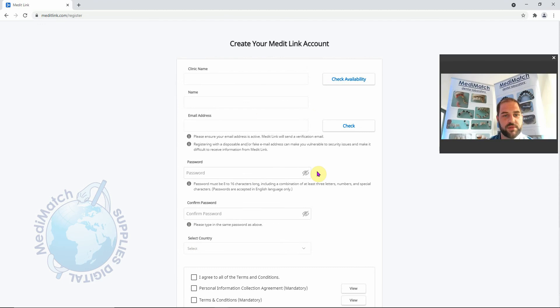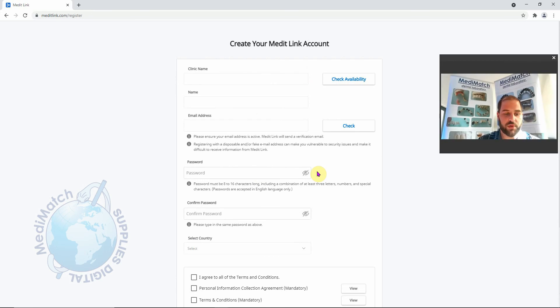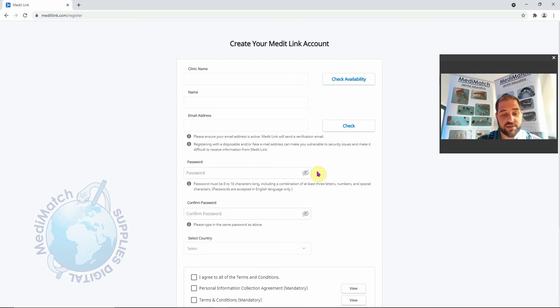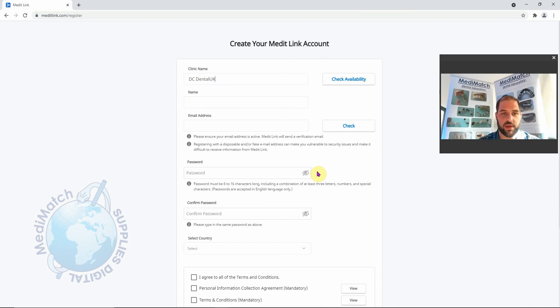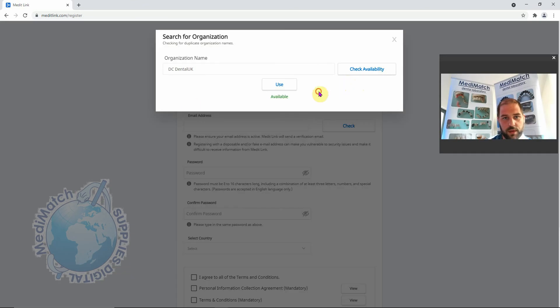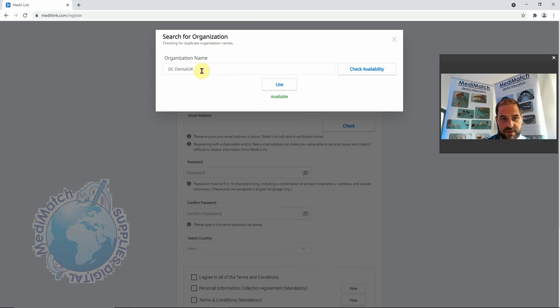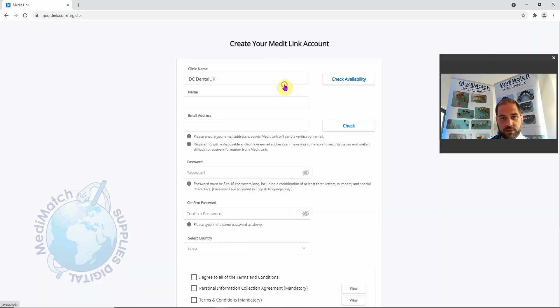So the first thing we need to do is put in your clinic name. Now this is how you will be seen by dental labs or anybody searching for you in the Medit system. I'm going to call myself as a demo DC Dental UK. It's important that you click check availability. That name is available, it's not been used by anybody else. If for any reason this wasn't available, somebody else had used it, it would give you the opportunity to try another name until there is one available that you can use. I'm going to click use.